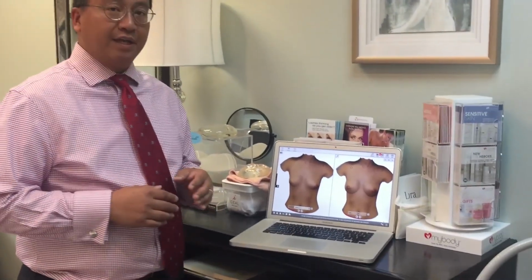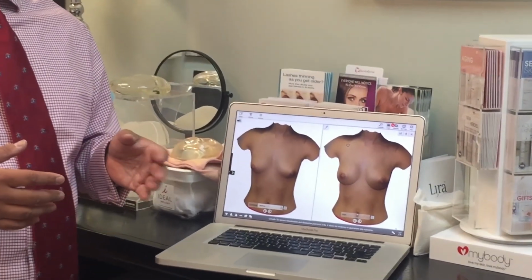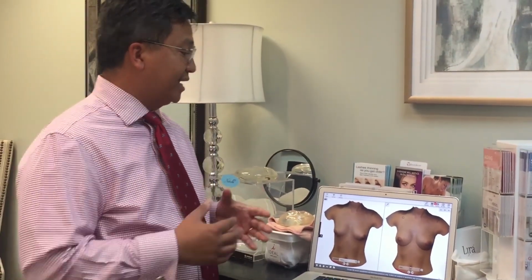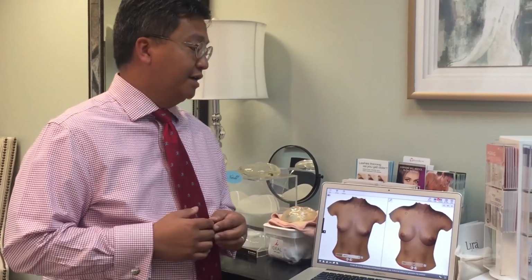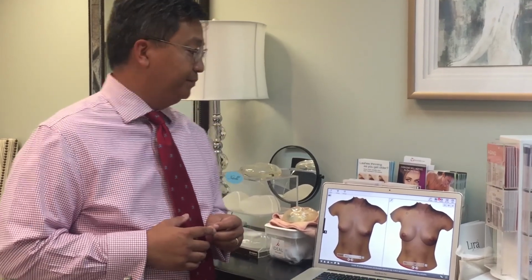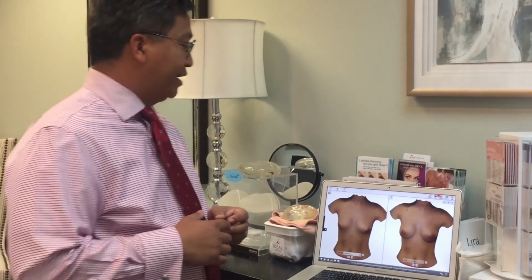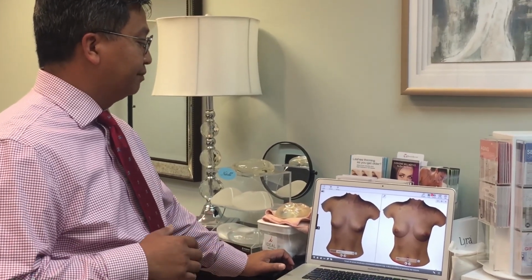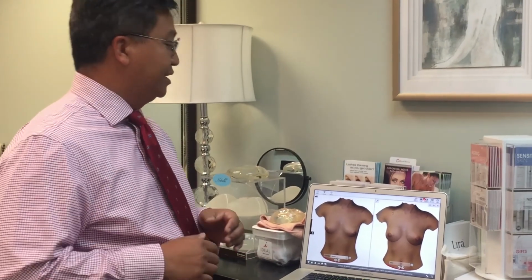It's called Chrysalix software, where not only can we simulate what implants look like in the body, but we can be really very tailored to your needs and wants by putting the exact CCs, the type of implant underneath the muscle, on top of the muscle, and we can have a great discussion about what's really going to achieve your goals. So I have here one of my patients, a lovely young girl who wanted just to provide a little bit of self-esteem and just enhance her breasts with breast implants.